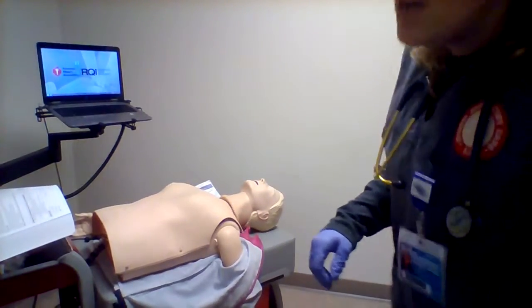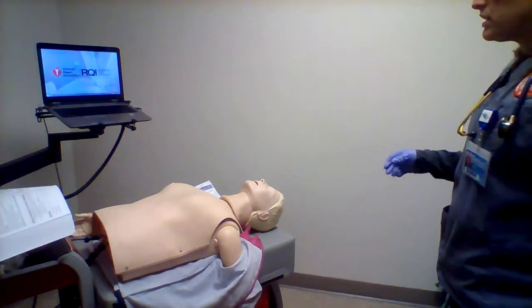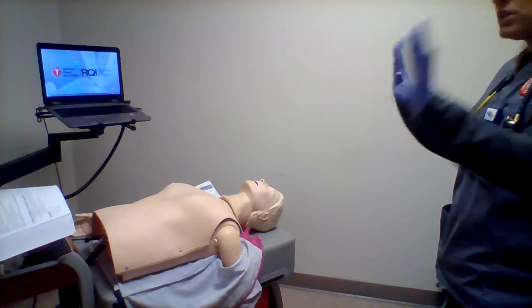Hi, I'm Claudine Lewis, a respiratory therapy care student, and I'll be doing some nasotracheal suctioning. I've already verified the order and assembled my equipment, washed my hands, and applied gloves.